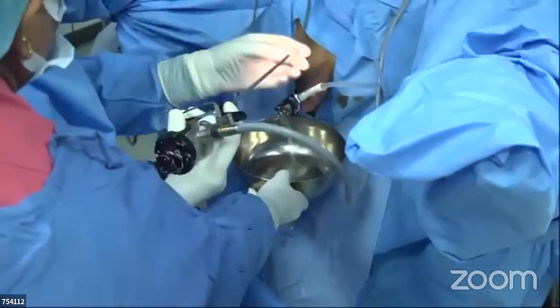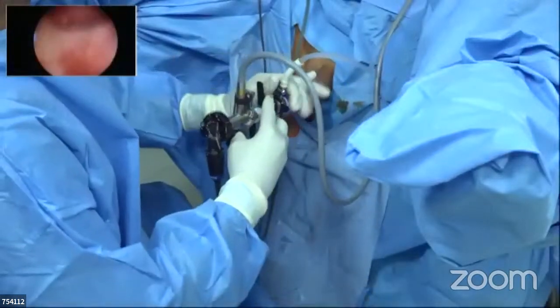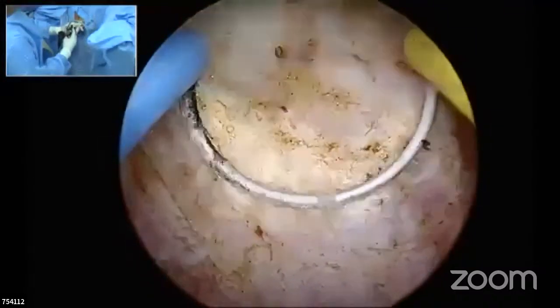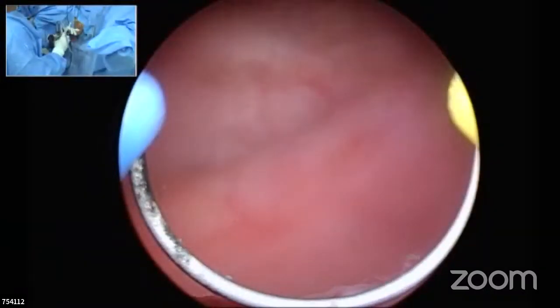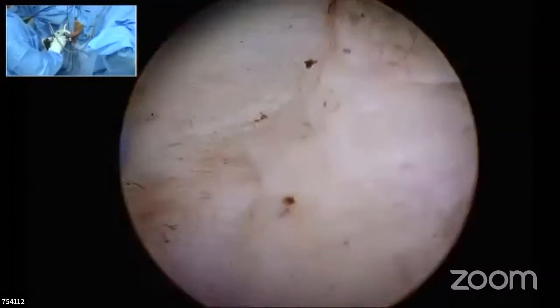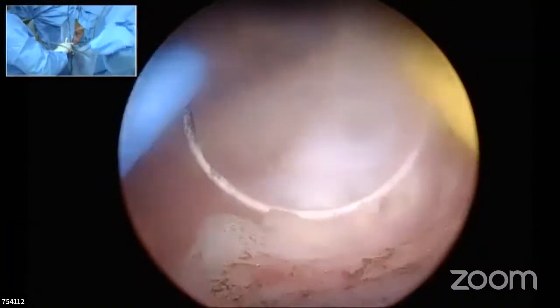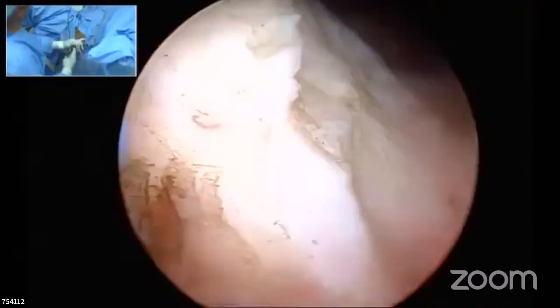I always tell the juniors that you need to look into the bladder whenever you have done an HoLEP. Don't say that HoLEP is the end of the procedure. You need to look into the bladder after HoLEP for two reasons. Number one, have the pieces come completely into an empty bladder? See that there is one chip which is still there. Number two, your HoLEP itself would have opened up some blood vessels now and then. So look for a blood vessel which is bleeding after HoLEP. This is a mandatory thing which needs to be done by everybody. People will just do HoLEP and put a catheter, which is not correct.